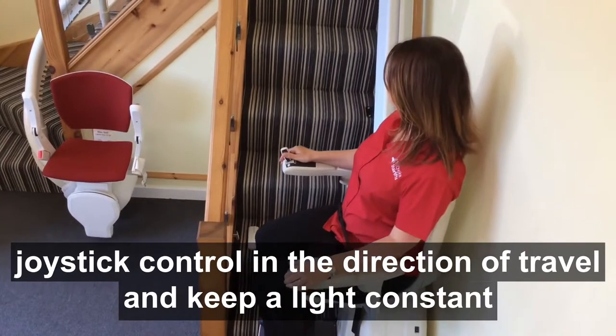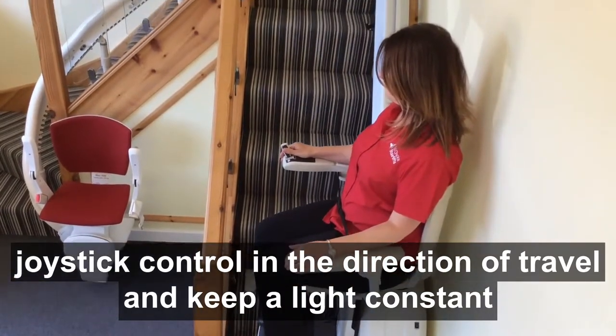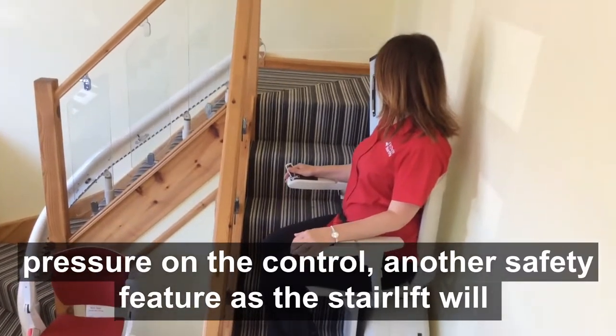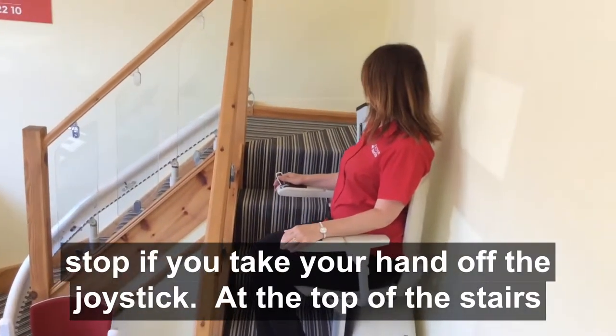Gently push the joystick control in the direction of travel and keep a light, constant pressure on the control. Another safety feature is the stairlift will stop if you take your hand off the joystick.